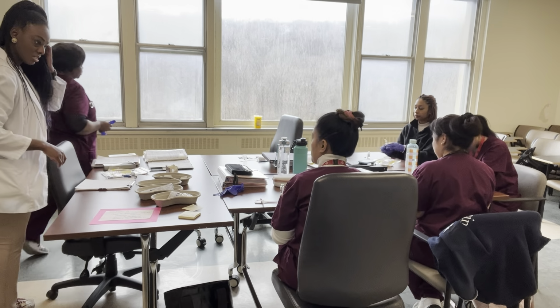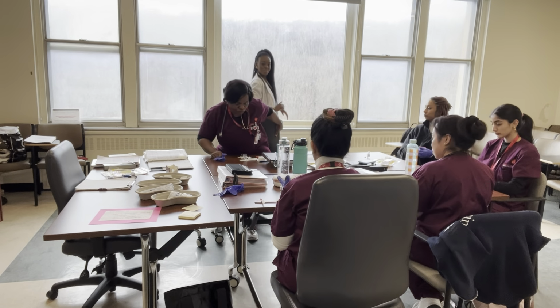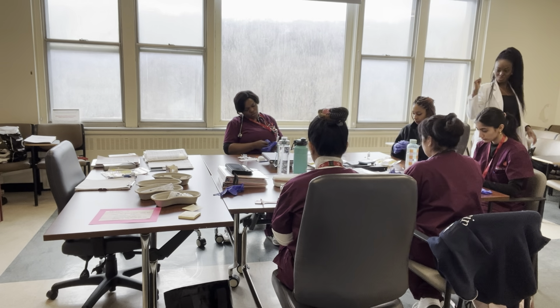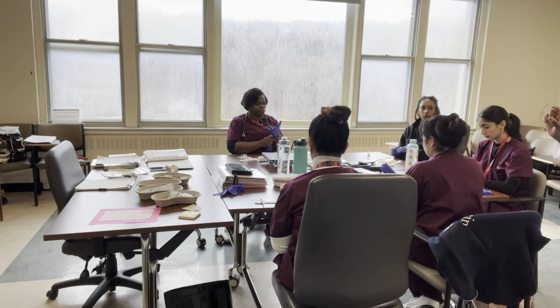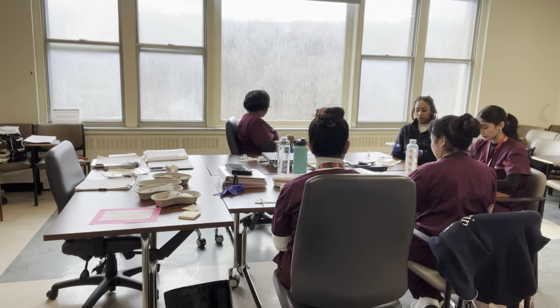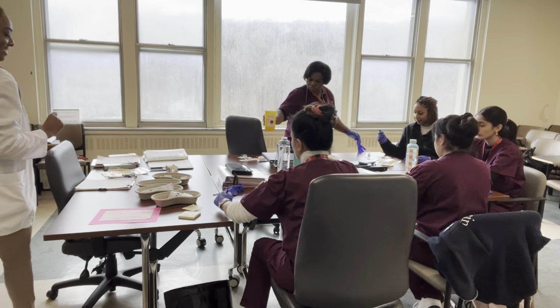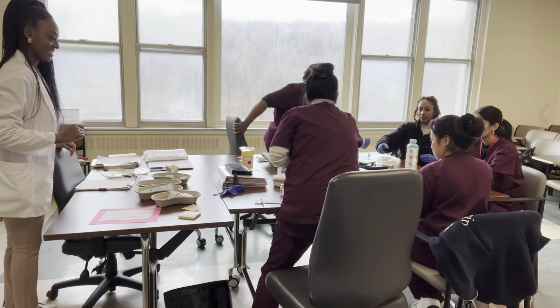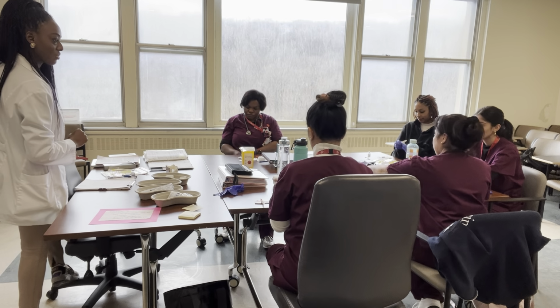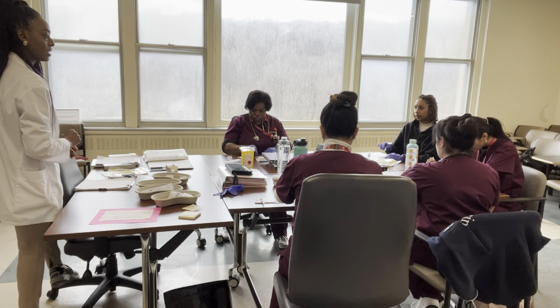So again, ID, excellent. What are you looking for in the room? The sharps container. Good, so my ID, it's right here. Sharps container is where you find it. Okay, so now the three of you, I'm watching. You can go ahead and clean up your mess, darling. I don't have an alcohol swab, but I will. Oh, you need to get your alcohol swab done. That was for you. All the supplies I prepared for you. Everybody, so the rest of you have all your supplies?